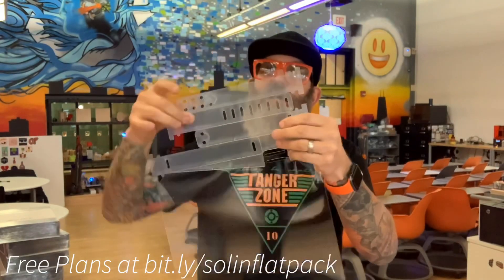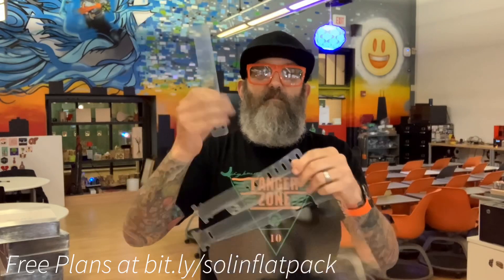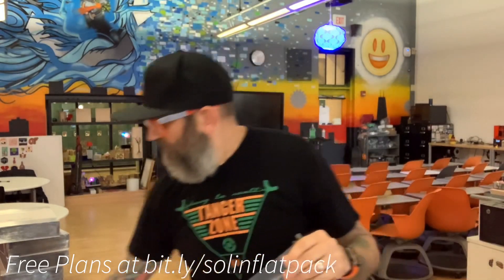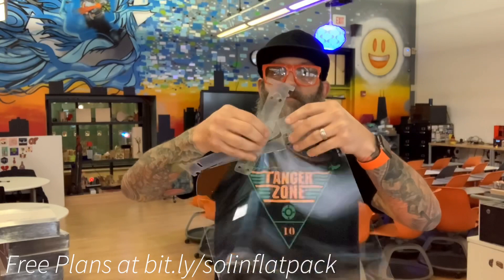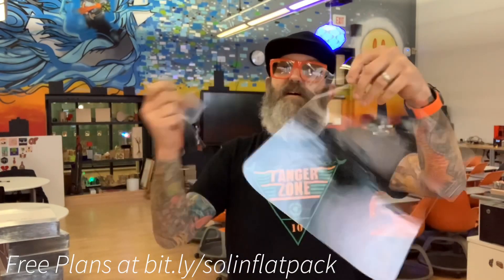There are two head straps right here and they just pull apart like that. Then two forehead straps — this is different than the previous design. And then there's one little piece of trash that keeps the pieces together.